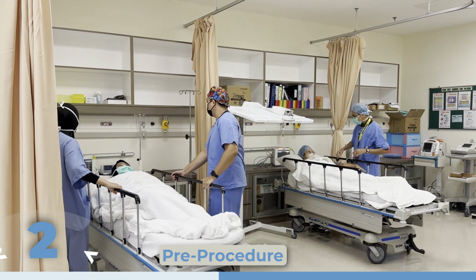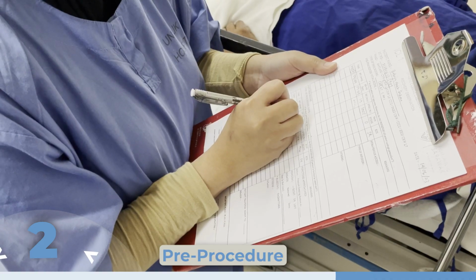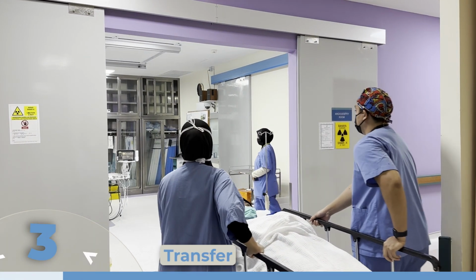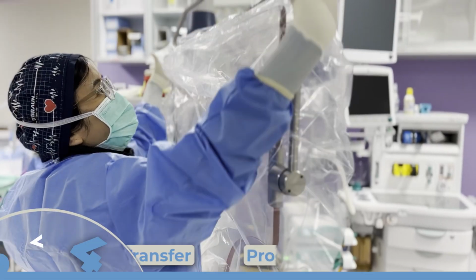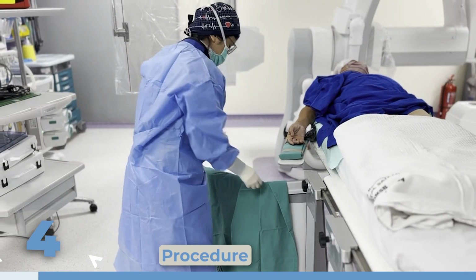Vital signs of the patient, such as blood pressure, heart rate, and oxygen saturation, are recorded and entered into the system for monitoring during the procedure. The patient is transferred to the angiogram suite, which is equipped with the necessary imaging equipment for the procedure. This is where the angiogram will be performed.